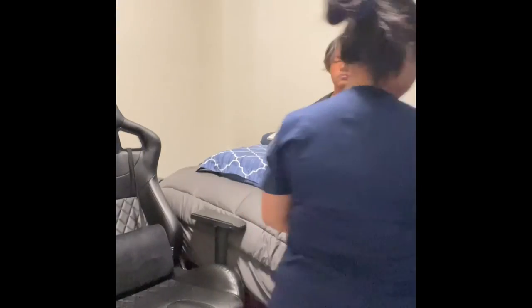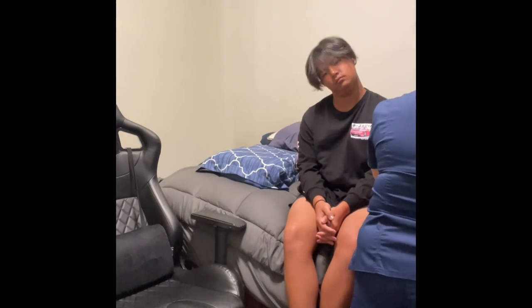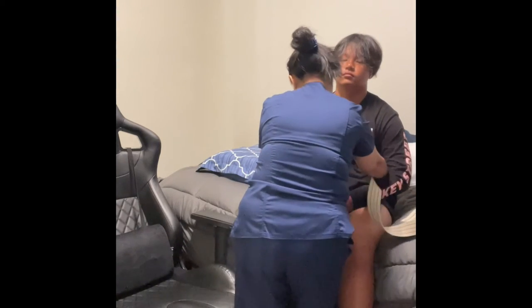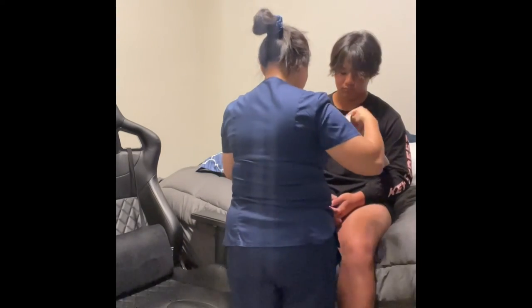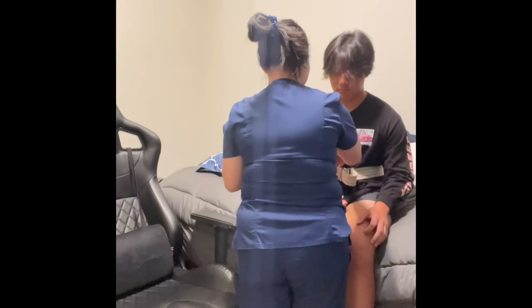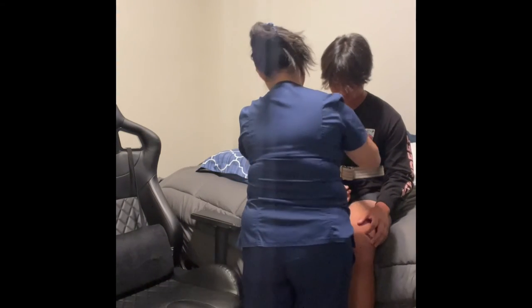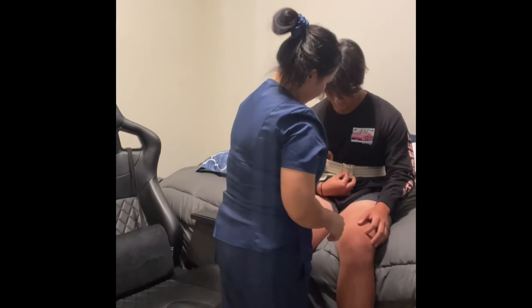Hello, Mr. Smith. I'm going to help you transfer to your wheelchair. I'm going to use a gait belt, so let me close this around you. Let me check if you're comfortable.